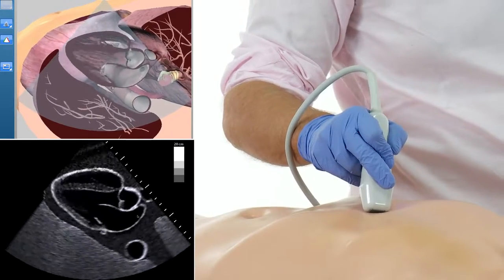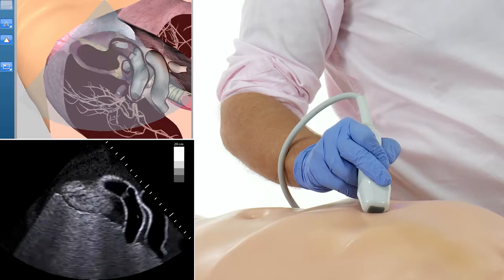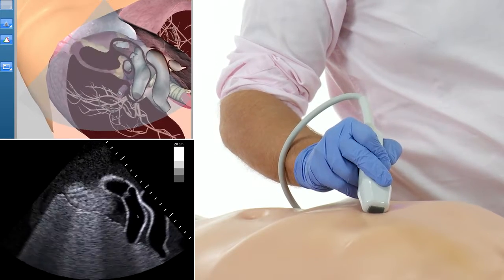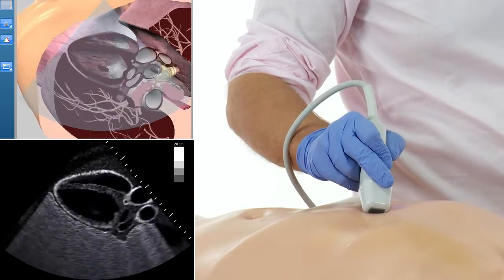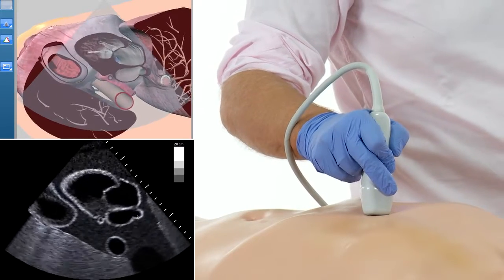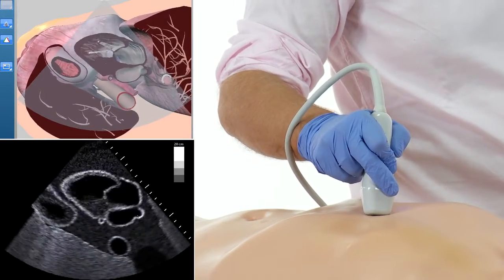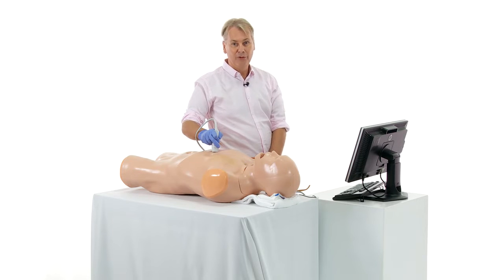If you tilt the transducer a little bit more cranial, you will all of a sudden see the pulmonary artery and the pulmonary valve. If you tilt the transducer to the other direction, more caudally, you will see the tricuspid valve and a so-called long axis view of the right ventricle. Both of these views are very important if you want to assess right heart pathologies.